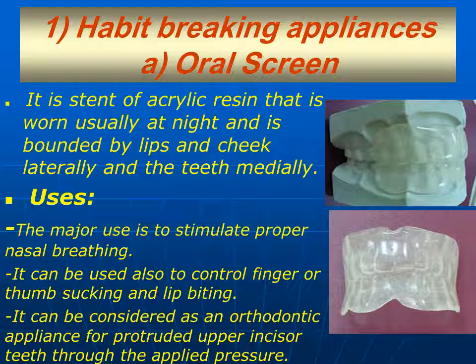Uses: the major use is to stimulate proper nasal breathing. That's to say, it is used in case of oral breathing. Also, it can be used to control finger or thumb sucking and lip biting.